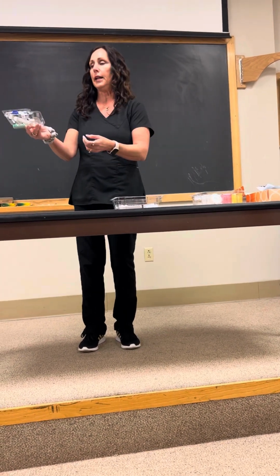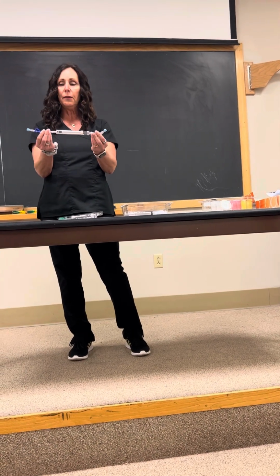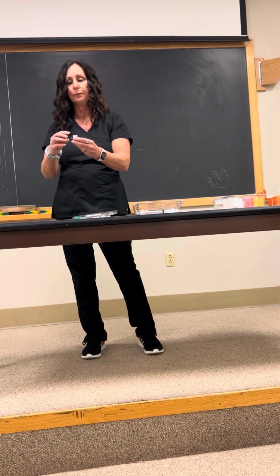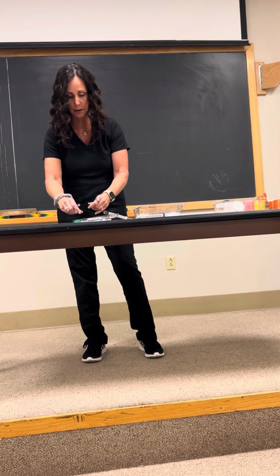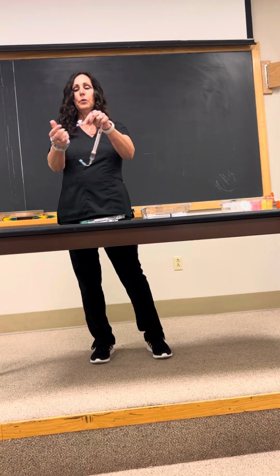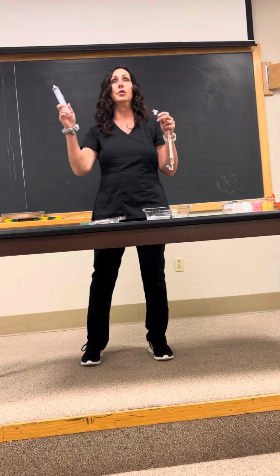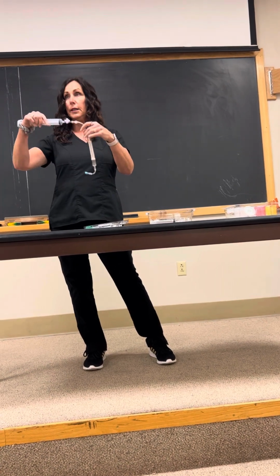So what I have you do is just take out that inner tray, pull out your filter, and there's a little bit of setup required with the filter. You can see there's a clamp at the distal end of it. And in this tray, there's a three-way stopcock with an off lever. So all you're going to do is connect to the distal end of the stopcock, and I will push my off lever to the very end of it, where I'm going to attach the 60 ml collection syringe that comes in the bottom of this tray. So you're going to filter the marrow into the 60.